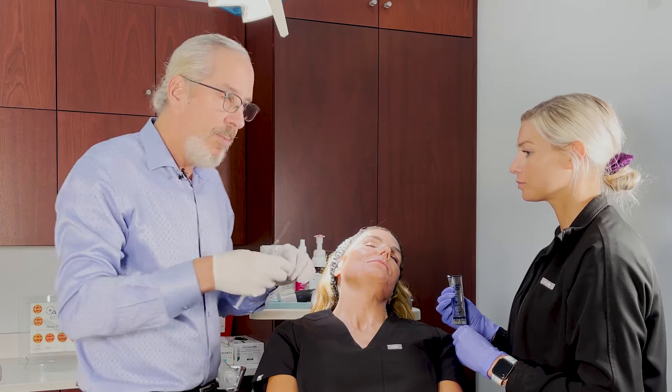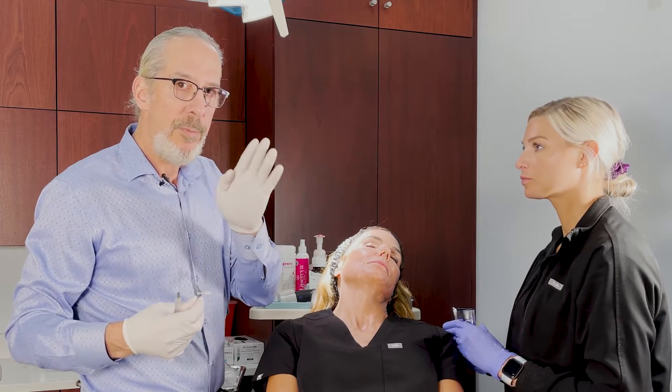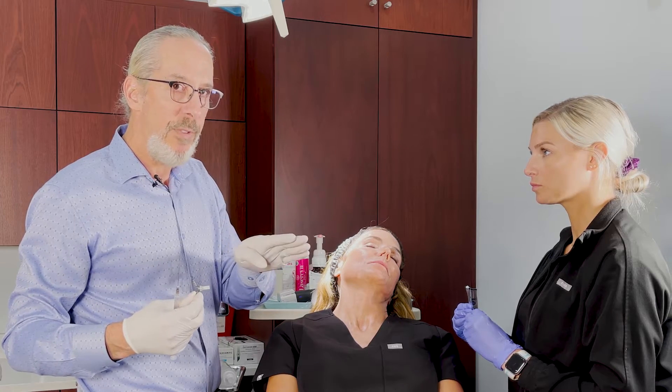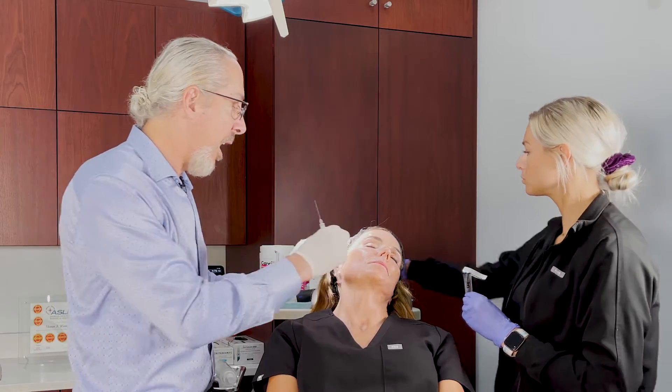I'm going to start with my injections in the temple. I like to put the injections into the space between the SMAZ, or the temporal parietal fascia, and the deep temporal fascia. I like to use a 22-gauge cannula and I use a soft fill easy guide.